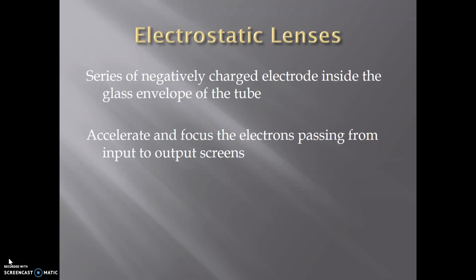Electrostatic lenses are a series of negatively charged electrodes inside the glass envelope of the tube. The purpose is to accelerate and focus the electrons passing from the input to the output screens.